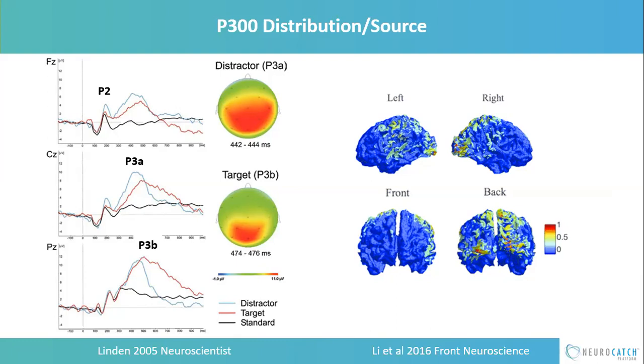This is actually good for training your human brain, because you can train your pattern recognizer by twisting the waveforms around and seeing if you can still see it. So let's walk through: you can see the early P1 dip, then the N1, and then the P2, which goes on to the P3. Hopefully you can see that and have been able to localize it. Now you can look at the features in the middle of the graph. The P3A has a very central parietal topography, and the P3B in this case is much more posterior.